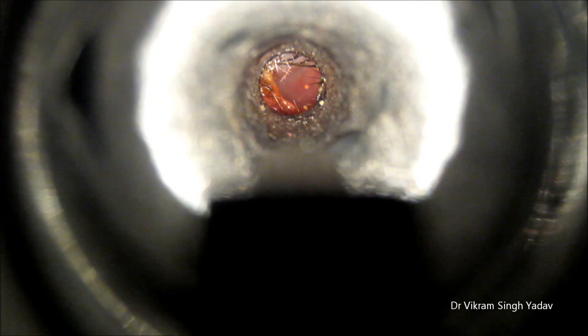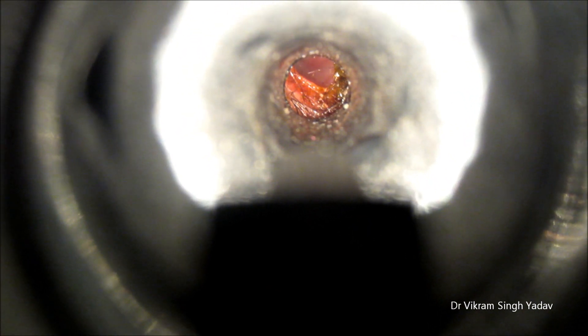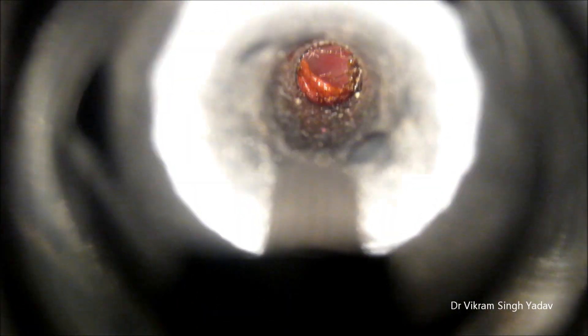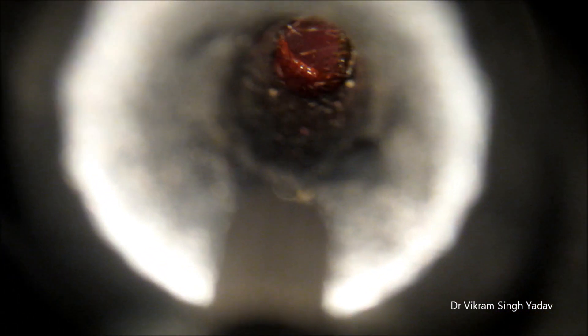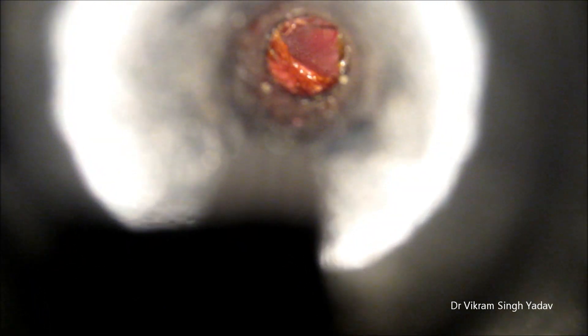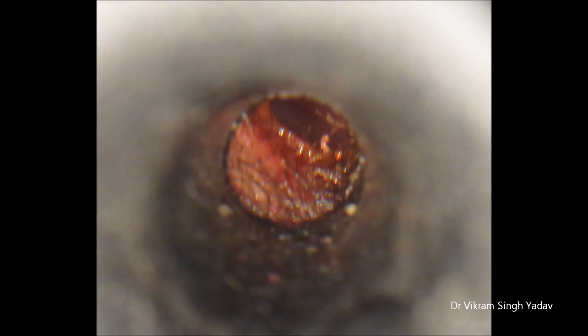Here is a similar case. This patient was cleaning the ear with a matchstick, and you can see the lesion — the trauma in the external auditory canal. You can see the skin is abraded there. Sometimes such type of injury can occur if you clean the ear this way.